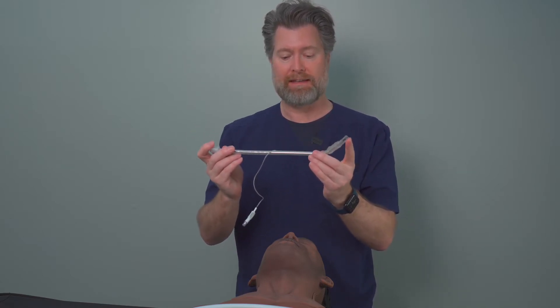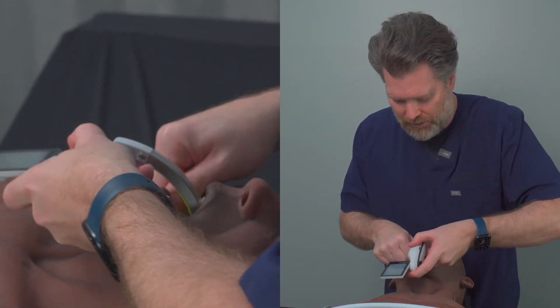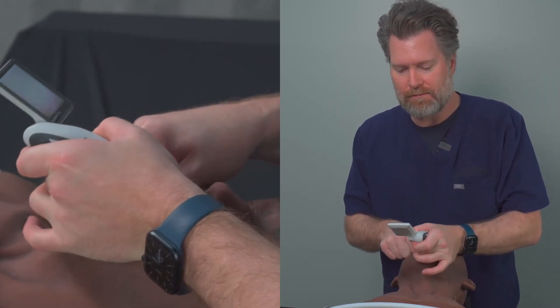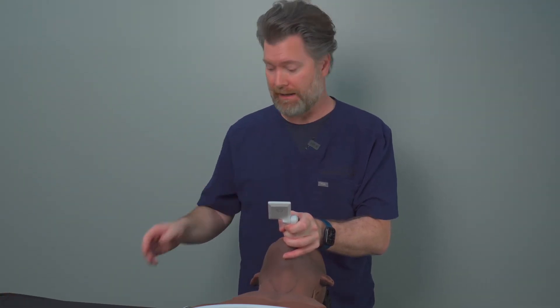Let's go ahead and intubate with that technique and I'll show you what it looks like. I'm going to intubate here using the McGrath and get the view that I want to get. Alright, now I've got a great view of the glottic structures.